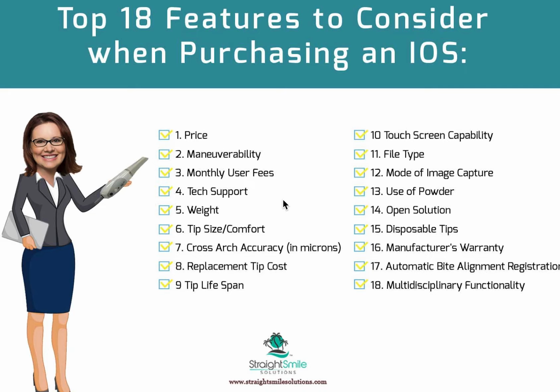It's really like a medieval torture device. And I'm not saying that your staff member can't finesse it to do it right, because everyone can do it gently, but if there's even more of a learning curve to get it comfortable, maybe it's not the right one. So, there are ones that are super petite and tiny and get around all those edges, without poking the patient.